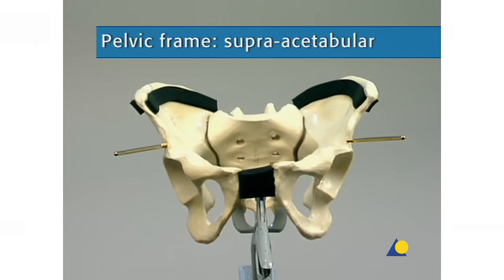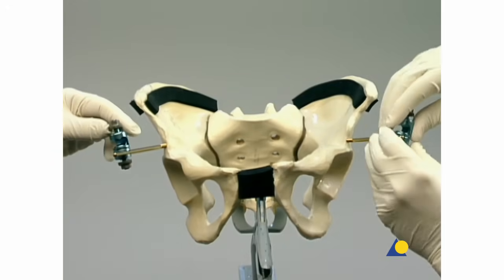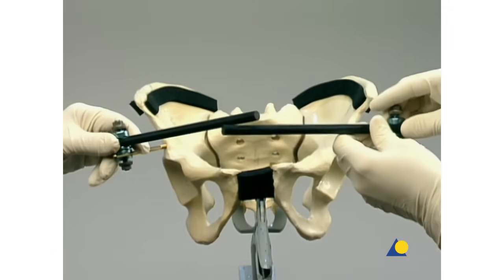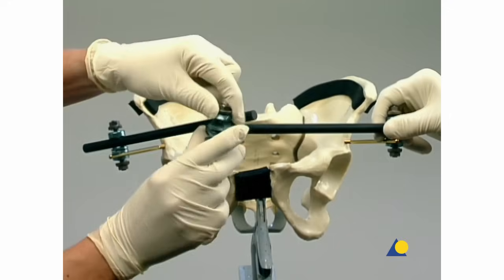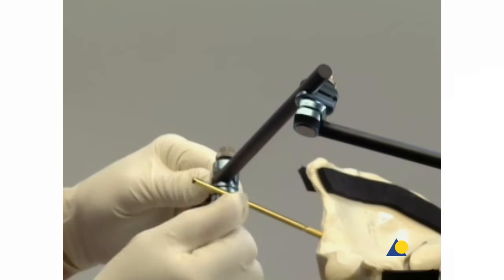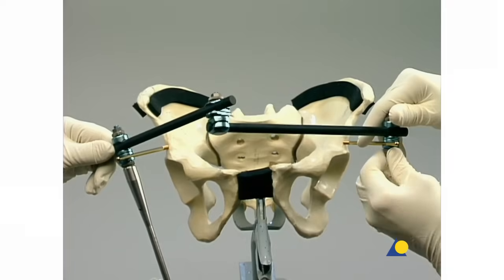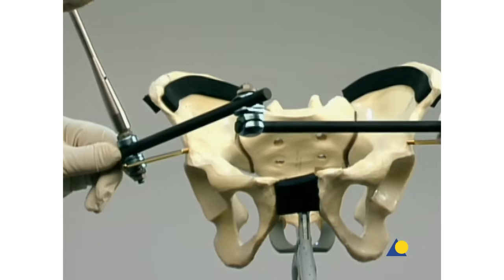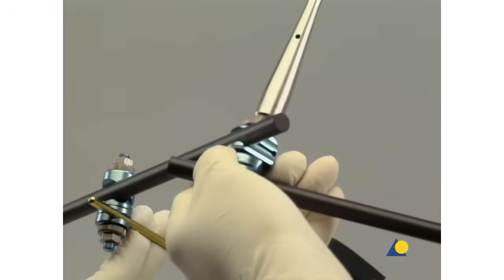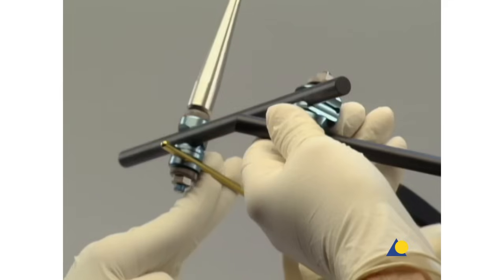The construction of the supra-acetabular frame is now demonstrated. An open adjustable clamp is attached to each of the Schantz screws. A carbon fiber rod is inserted into each of the open adjustable clamps, and the rods are connected with a combination clamp. The clamp nuts are first tightened by hand. The cannulated socket wrench is used for provisional tightening. Lateral compression is applied to the base of the Schantz screws and the pelvis, resulting in a reduction of the symphysis pubis. The reduction is maintained by tightening the combination clamp and then the open adjustable clamps.